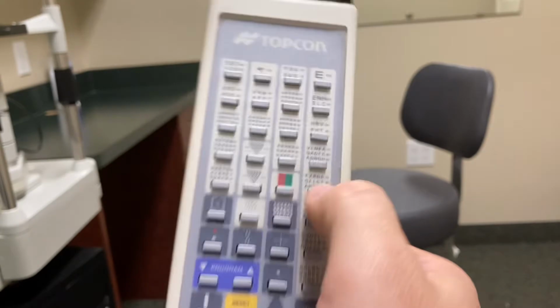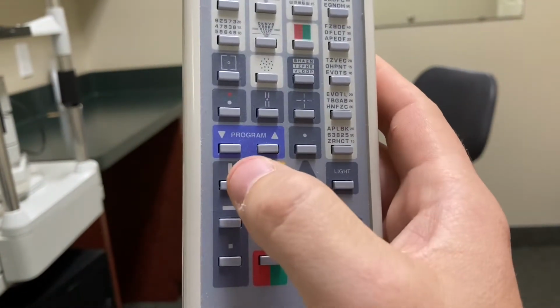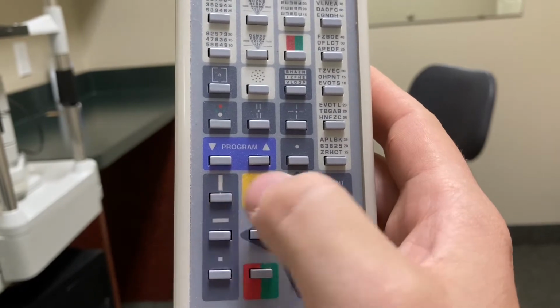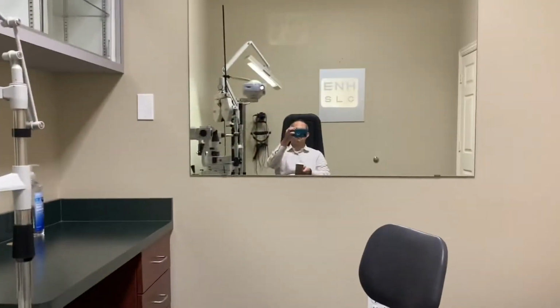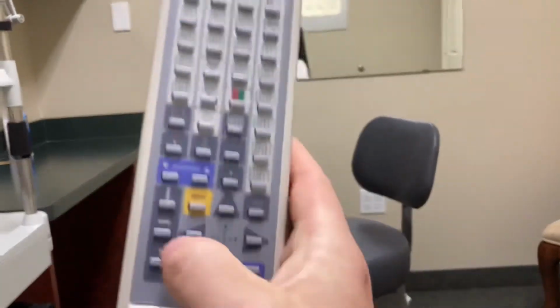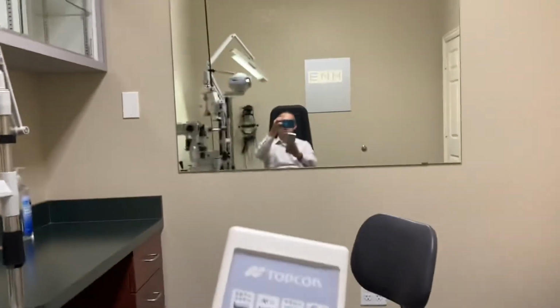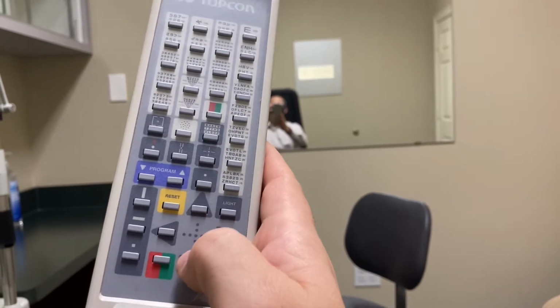And they let you, on any of these, on the numbers, the pediatrics, the tumbling E, or the Snellen, it lets you isolate a row, a single dot, or an up-down column, and then progress through that. So I'll go big on the Snellen letters, and then we're gonna choose just a row, boop, and then I can just push down and make it progress on the row.